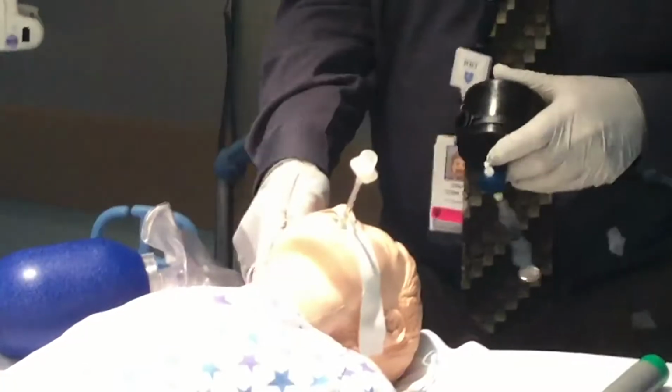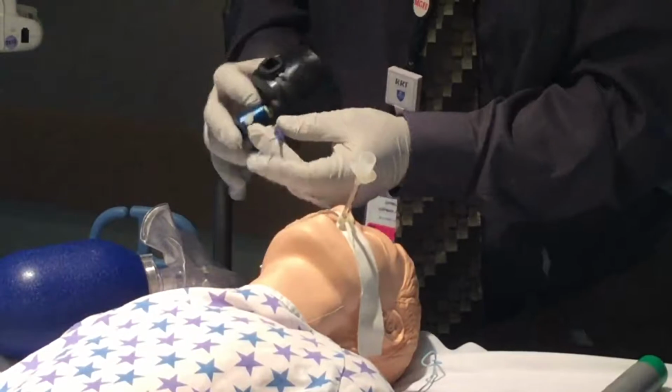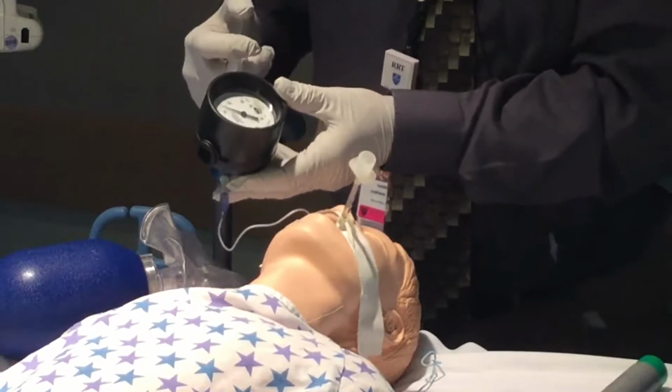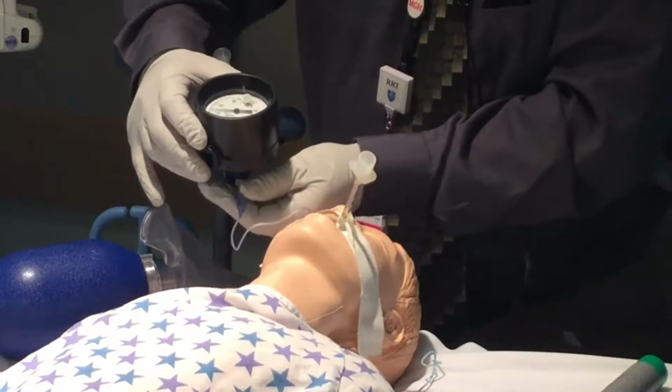It has been secured. Now we want to be sure that the pressure in the cuff is not excessive. I'll use a manometer with a syringe, connect to the tube, and inflate to a pressure greater than 20 but less than 30 centimeters of water.